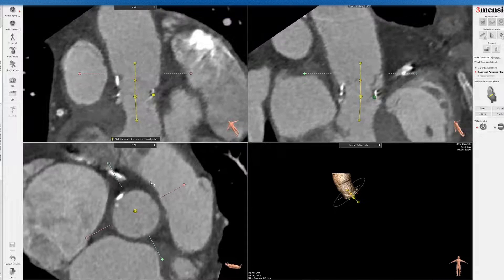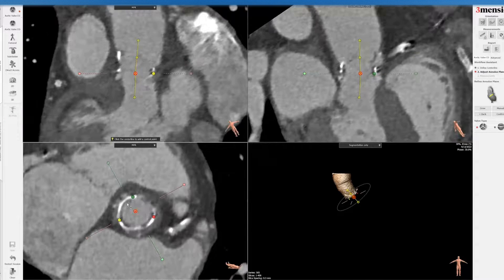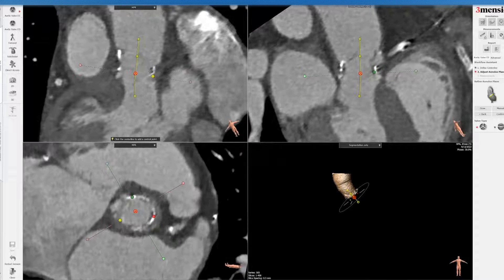Keep in mind that surgical valves are sometimes deformed or distorted, so it can be potentially more difficult to actually measure them accurately. I'm going to go back to the analyst now. You can see it's not quite at the center, so I'm going to try to correct that.